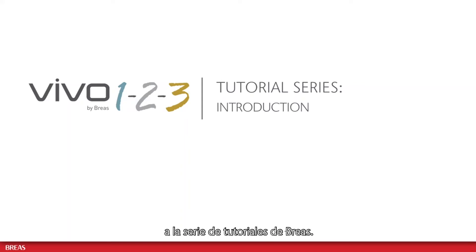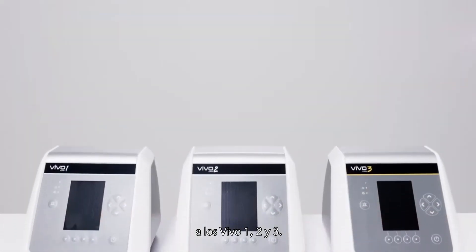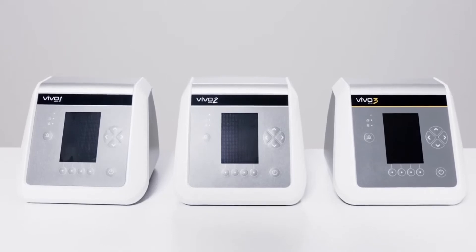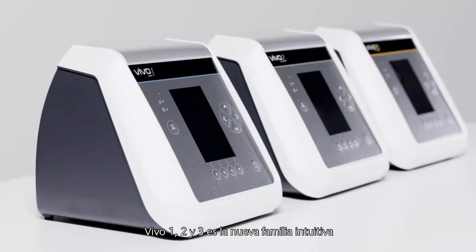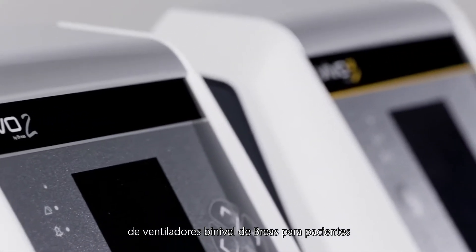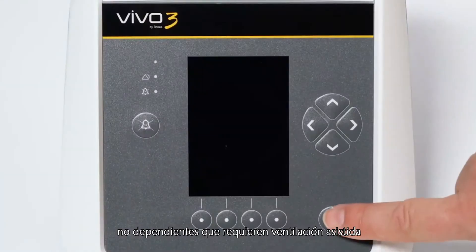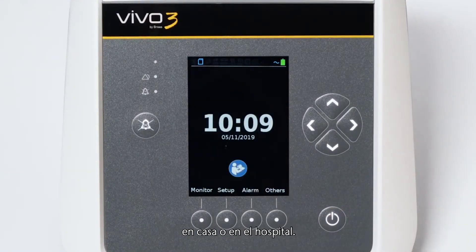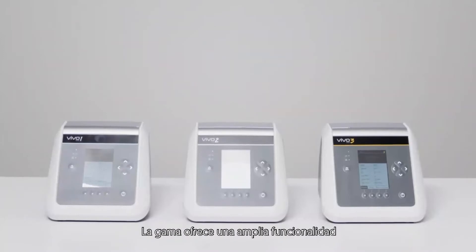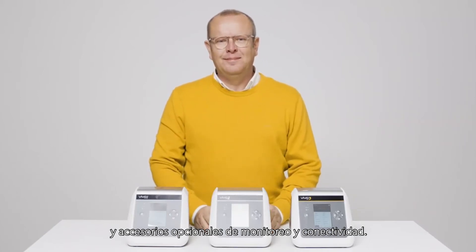Hello and welcome to the BreaS tutorial series. In this video, I will give you a short introduction to the Vivo 1, 2 and 3. Vivo 1, 2 and 3 is the new intuitive family of bi-level ventilators offered by BreaS, which are intended for non-dependent patients requiring ventilatory support at home or in a hospital. The range offers extensive functionality with three different models and optional accessories for monitoring and connectivity.